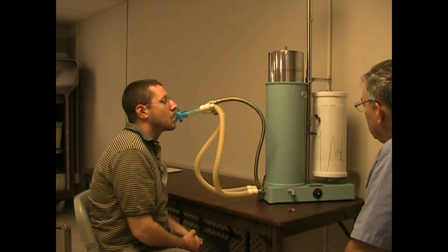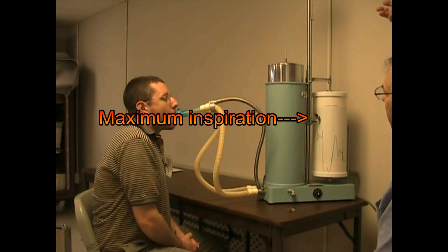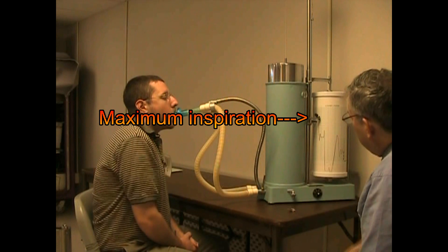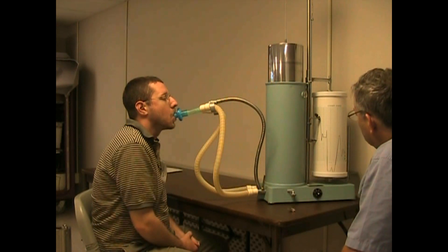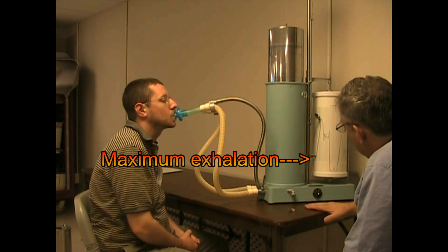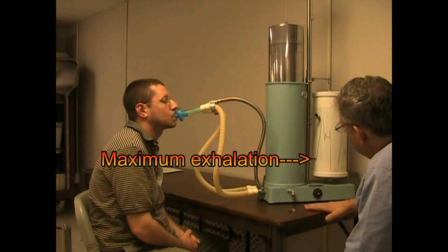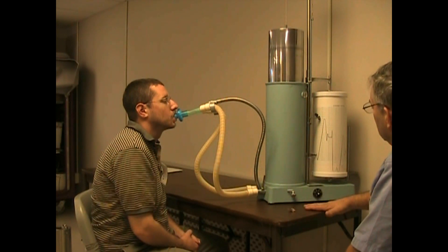Normal, easy breathing. Big breath in — suck deep, real big, keep going, keep going. Blow it out, ease it out, keep going, keep going. Squeeze it all out, keep squeezing. Okay, normal breathing. Very good. Excellent.